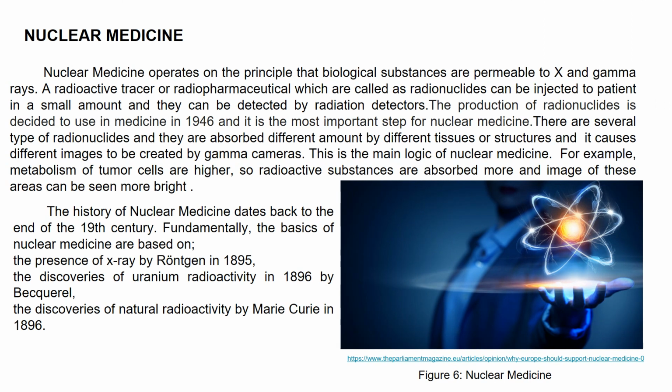Nuclear medicine. Nuclear medicine operates on the principle that biological substances are permeable to X and gamma rays. A radioactive tracer or radiopharmaceutical, which are called radionuclides, can be injected into the patient in a small amount and they can be detected by radiation detectors.